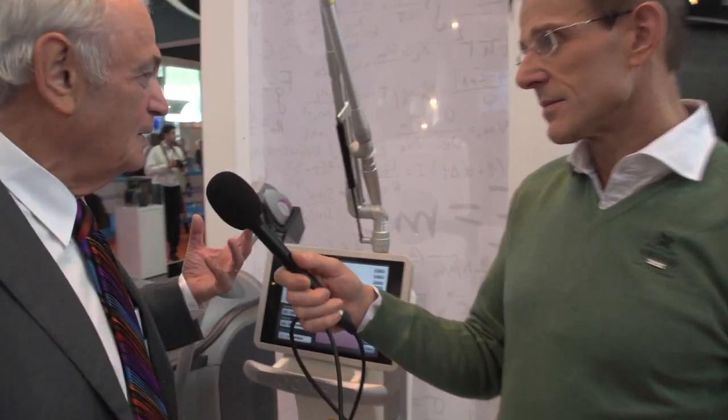This is called VelaShape technology, which is very effective for treatment of either young people, like women after giving birth, as well as older people, older women that have cellulite or have loose skin that they don't like. So that's a different treatment, but that goes way deeper into the skin, way beyond the dermal layer, just like in the hypodermis. Exactly. What it does is it goes all the way to the layers underneath the skin, the hypodermis, and all the way into the fat itself.